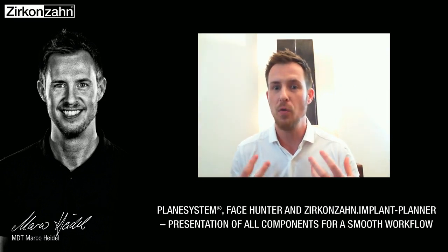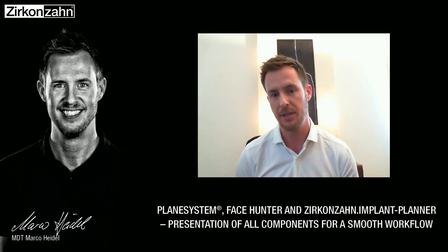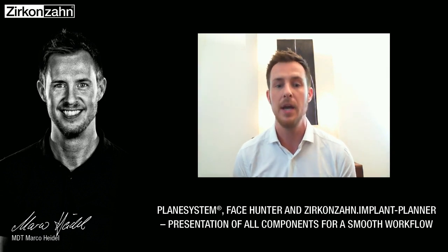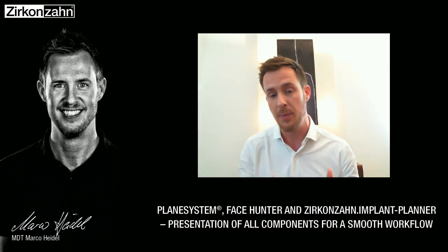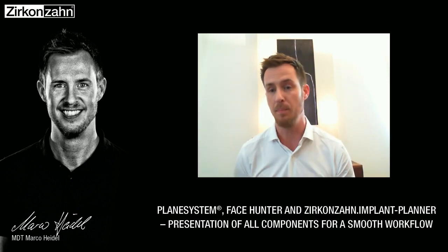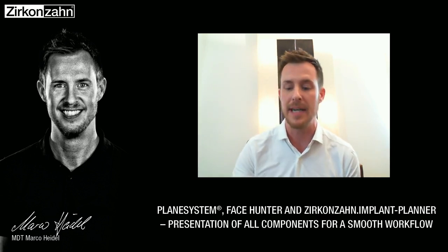Well, what is the perfect workflow when we don't have enough information about the patient? It's very important to collect all necessary information, and we have the possibility to use several instruments to get those information, to get in the end the patient as a 3D patient in our computer to work with. This whole concept workflow is called CDD, Computer Dental Diagnostics.